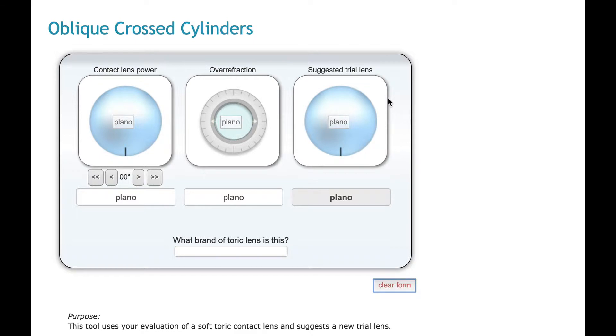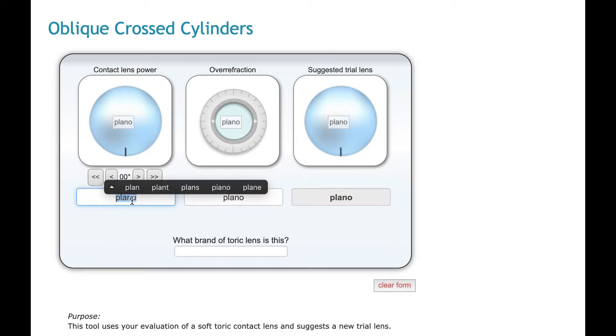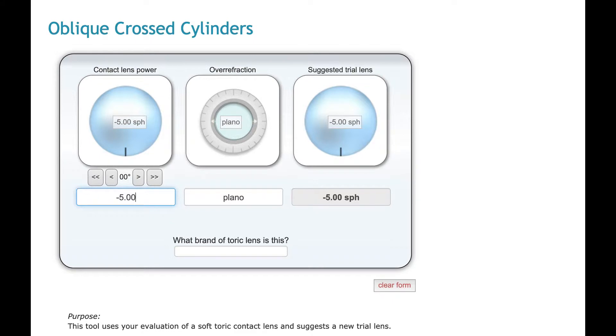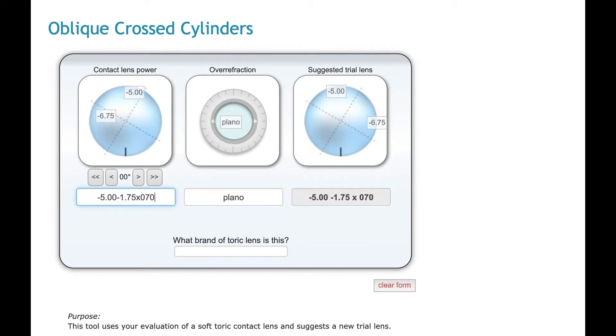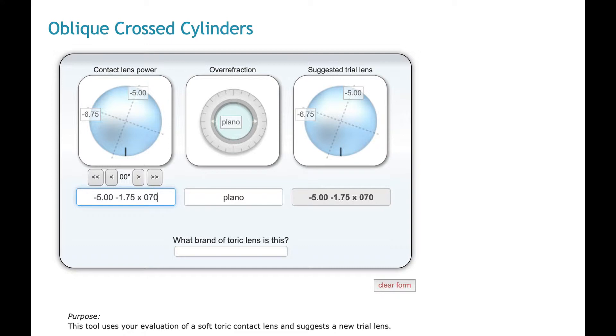I try to make it real straightforward and easy to use. There are three columns. The first one is the contact lens power. So I can type in the powers of a contact lens in just a normal format. I'll say minus 5 minus 1.75 axis 70. I try to make this real visual. For everything that you type in here, it'll show you the powers on an optical cross. So you can really kind of visualize how these powers are lining up on the eye.